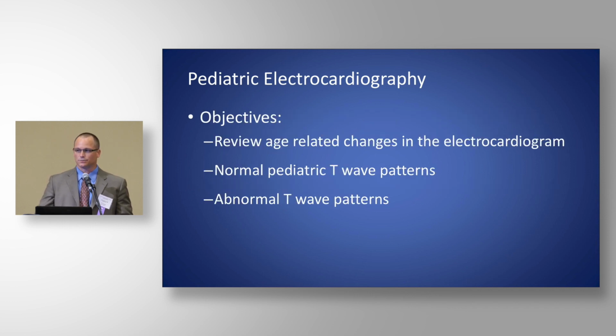So what then are the objectives? First of all, we're going to review age-related changes in the electrocardiogram. Then we'll look at some normal pediatric T-wave patterns. And then finally, some abnormal T-wave patterns.